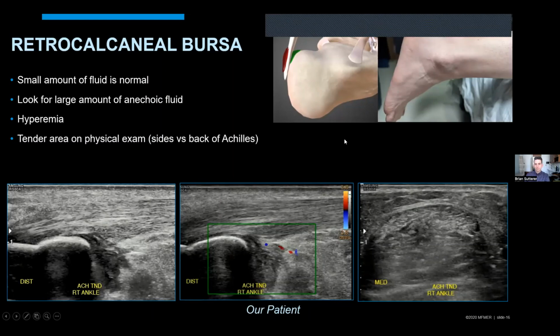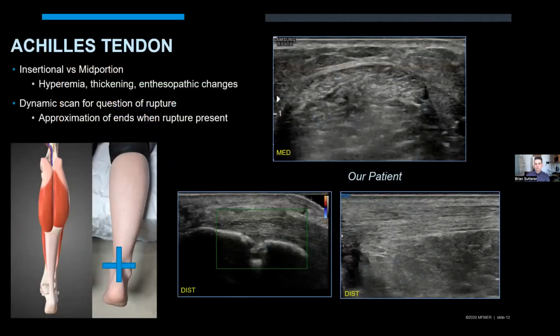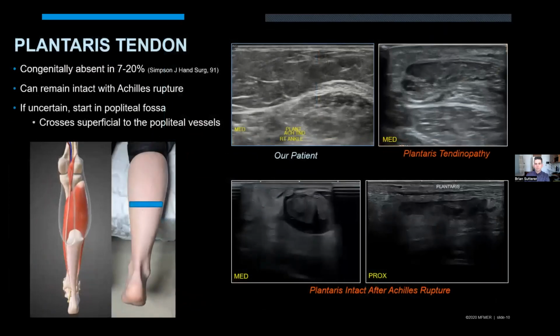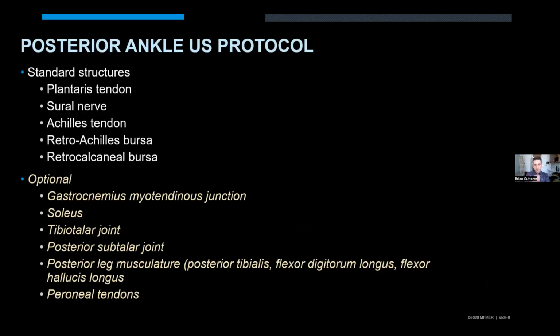Yeah, going back to the protocol. With my protocol, and this is really the same discussion that you can make with your protocol for plantar hindfoot pain, I specifically lay out what images I get of the Achilles. I divide up the distal Achilles from the mid portion of the Achilles, as you pointed out. I also put an extended field of view as part of our protocol. I find that really helpful just to see the big picture. So that's one of the images in my protocol. Sural nerve, plantaris, as you have.